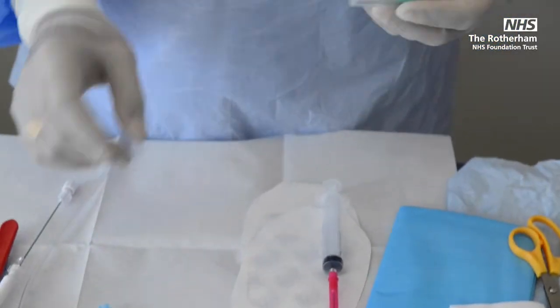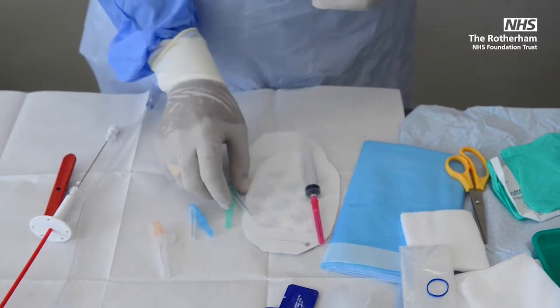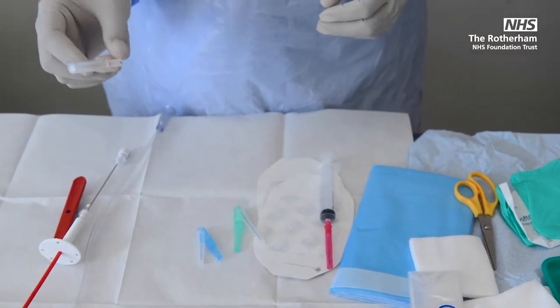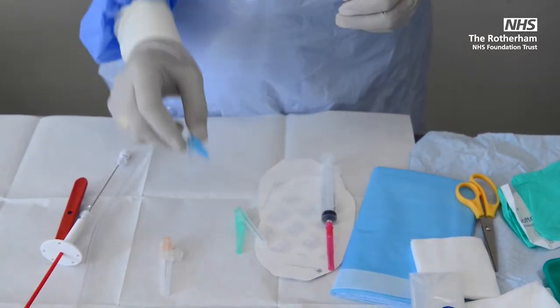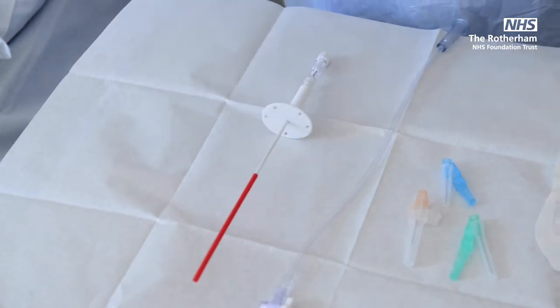Next, you need the green needle, the blue needle, and the orange needle. So the orange needle is to anesthetize the skin. Then we go a bit deeper with the blue one, and then the green to go further down. And you've got the scalpel.